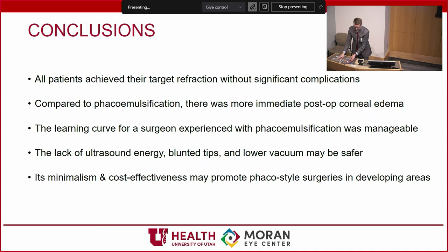So it's interesting, you do think, no one's done the carbon footprinting on the amount of carbon footprint going to this versus a typical phaco pack. I would imagine it'd be similar. There are some metal pieces here and you don't have that in a typical phaco pack, but that's another interesting question. Do you know what they're going to charge for the reusable stuff? Yeah. In short, more than a phaco pack.